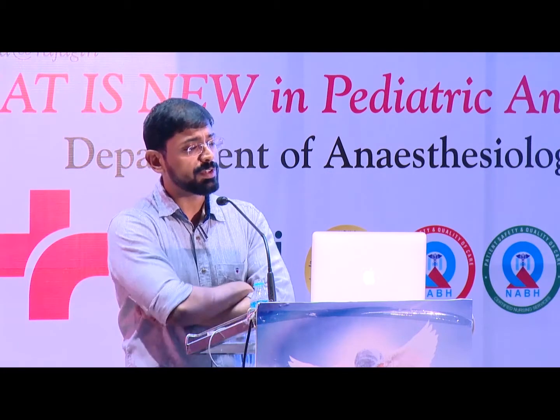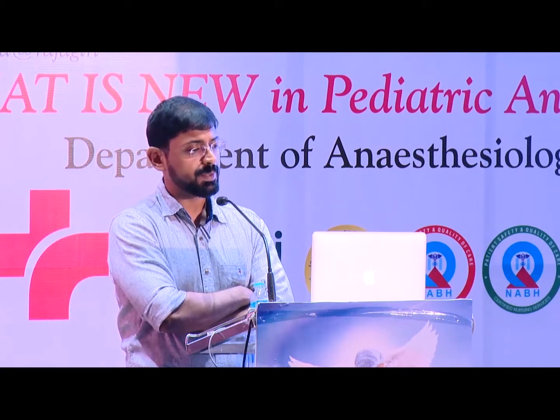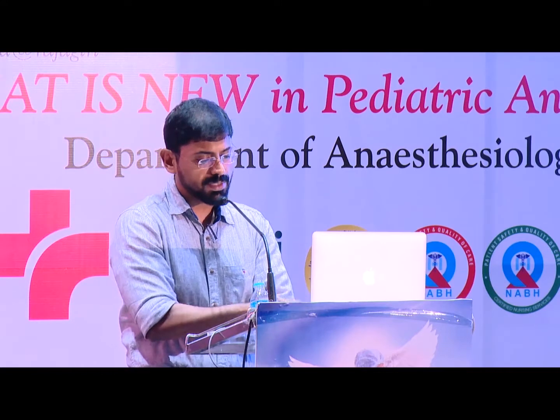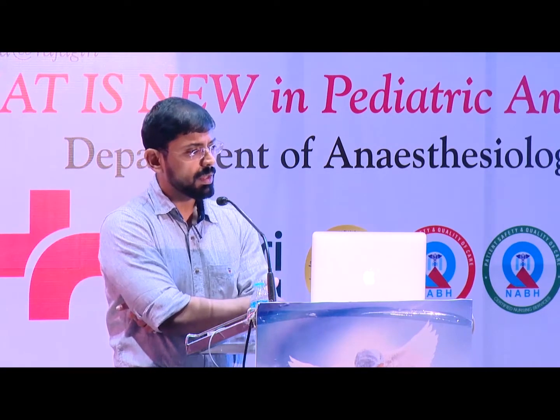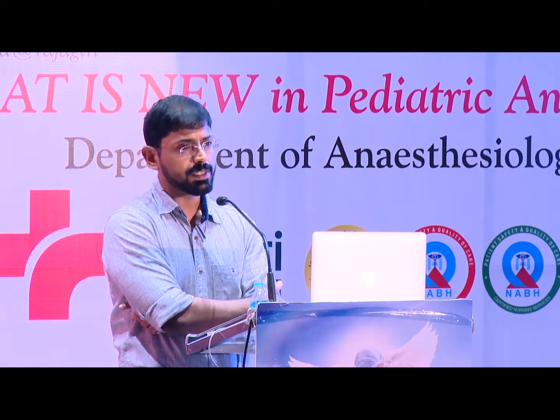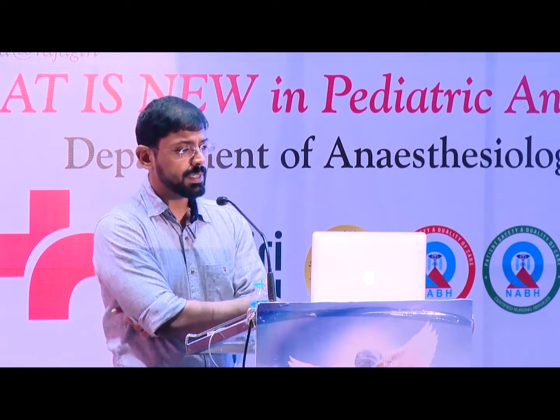An I time of 0.35 seconds. The normal ratio of inspiration to expiration in newborn babies would be roughly 1:2, and a comfortable working range for the I time would be between 0.32 to 0.38 seconds. The ideal range of flow in neonatal ventilation would be between 8 to 12 liters per minute, and in cases where you have to deliver very high PIP, it would be essential to give a minimum normal range, sometimes between 12 to 15 liters even.